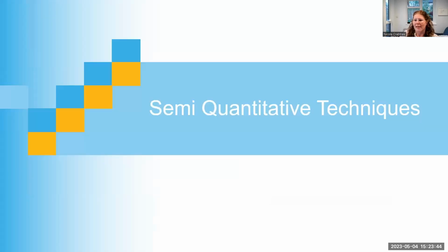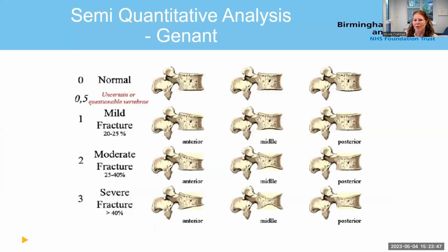What about semi-quantitative techniques? I'm sure most of you are familiar with the semi-quantitative techniques by Genant et al. Here we use a combination of looking at the shape of the vertebrae. So we're looking at wedging, biconcavities, or crush, and then we define the degree of that deformity by how much height is being lost. You can look at the image and measure the height on the ones where you think there may be a deformity. And he identifies three grades: mild, moderate, and severe. And this has been widely adopted certainly throughout adults and much so with children as well.